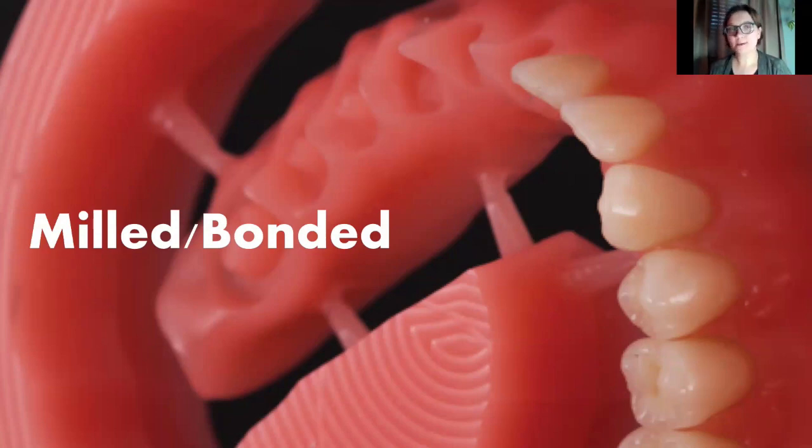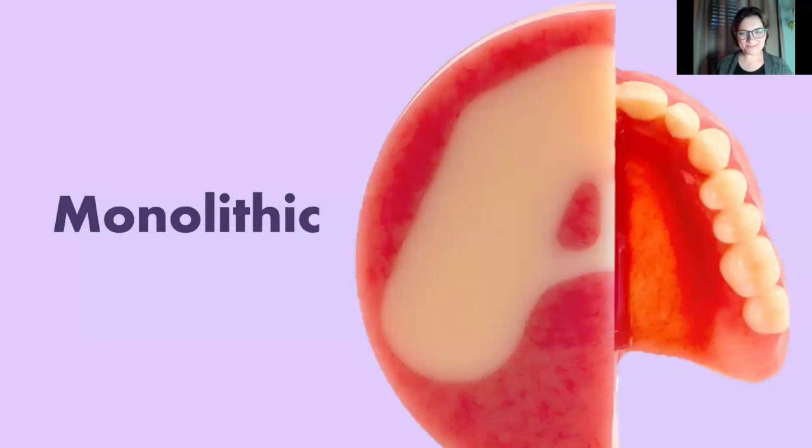If you prefer something a little different, if you don't have a denture tooth you love, for example, you can use a monolithic denture. This, to me, was so exciting when I learned about this several years ago. What they do is when they make that puck of polymethyl methacrylate, they're actually putting the tooth shaded PMMA and the denture base PMMA into the same puck. And so this is all prefabricated before the design is milled. And what you see here is the denture teeth are now part of the same product as the denture base.